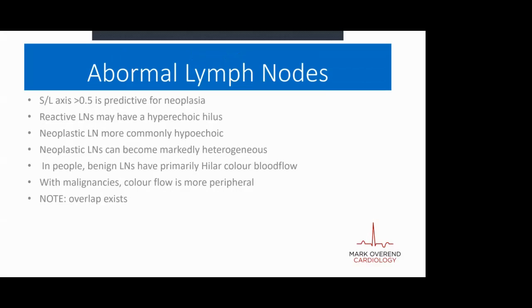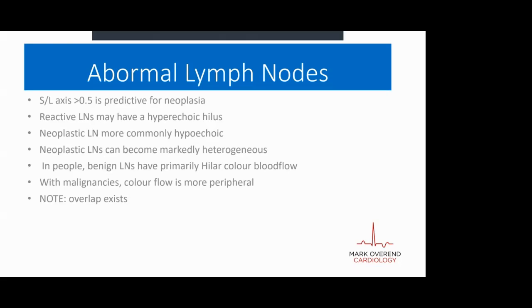Abnormal lymph nodes tend to be short and plump. The short to long axis ratio greater than 0.5 tends to be predictive for neoplasia. Looking at the difference between reactive and neoplastic lymph nodes: reactive lymph nodes tend to have a hyperechoic hilus, whereas neoplastic lymph nodes tend to be more commonly hypoechoic. Neoplastic lymph nodes also quite often become markedly heterogeneous compared to reactive lymph nodes.